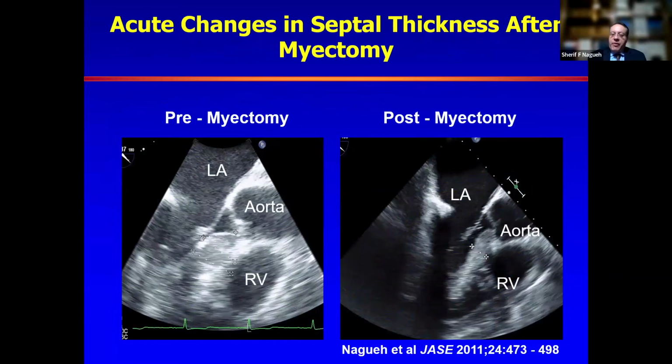Septal reduction therapy is guided by imaging, and this is an image taken from a patient undergoing myectomy. The purpose of imaging during myectomy is not just that there is obstruction and what the gradient is. It is to help the surgeon plan how much resection he or she needs to do. And here you pay attention, yes, to the thickness of the septum, as you see in that dotted line, but you also pay attention to the vertical extent.